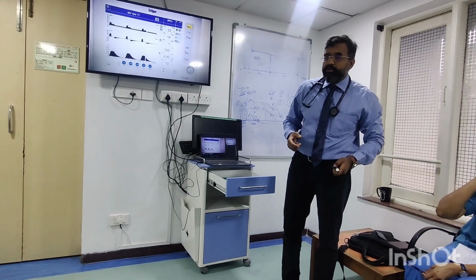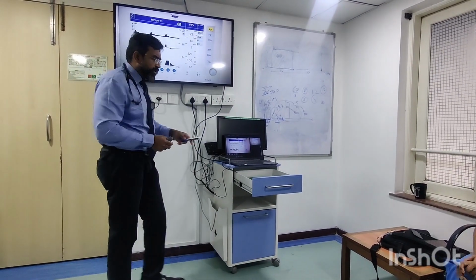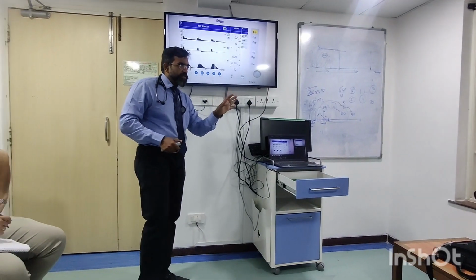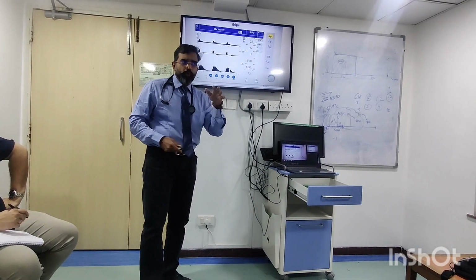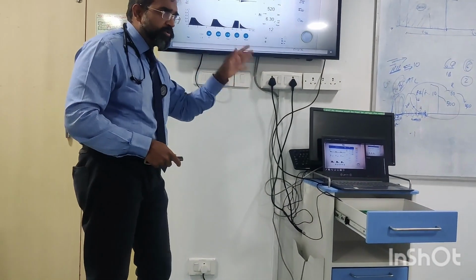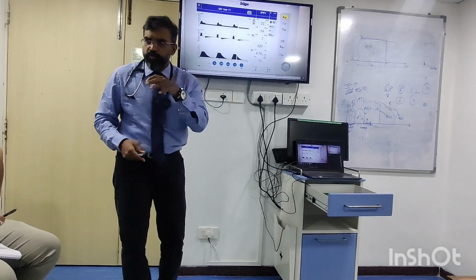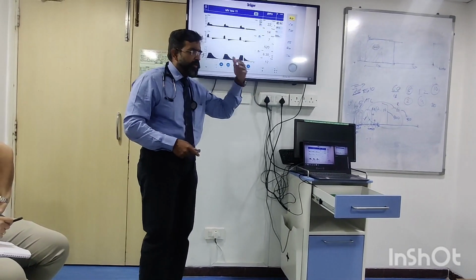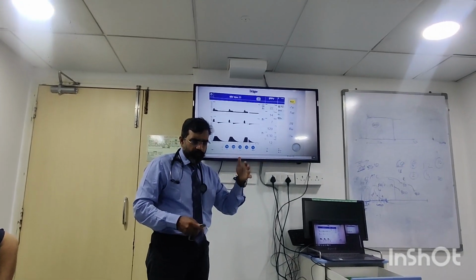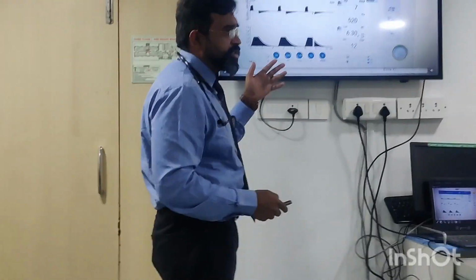So now this is our ventilator. This is our regular ventilator that we're using. I've done this so that you understand what we're doing with our machines, specifically to understand all these waveforms, all these breath delivery types. Whatever we have discussed now is on the machine. Whatever machine that we are using has the same waveform. So now you understand what is happening. We discussed we have three waveforms. We had the pressure waveform, we had the flow waveform, and you have the volume waveform. Right? This is what we discussed. Clear? So if you look at it, which is the pressure waveform, Vidya?